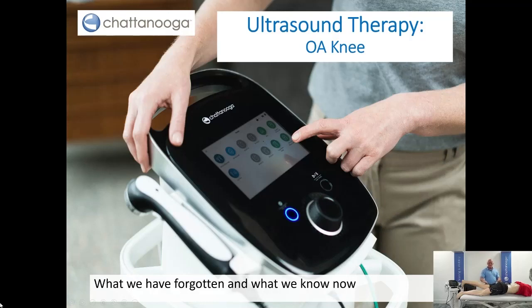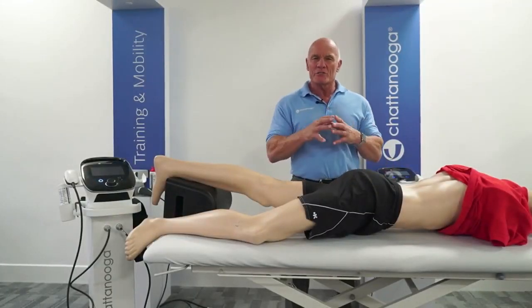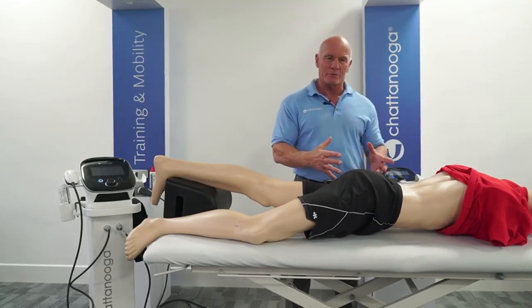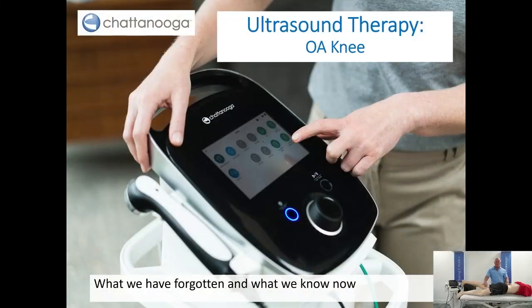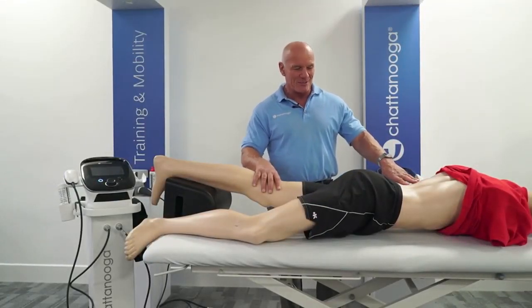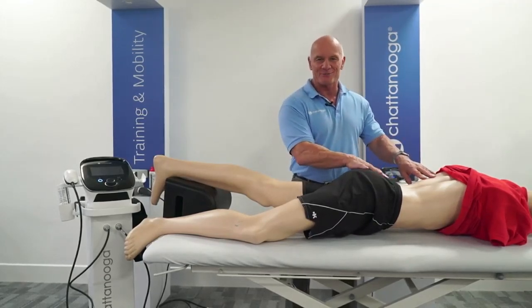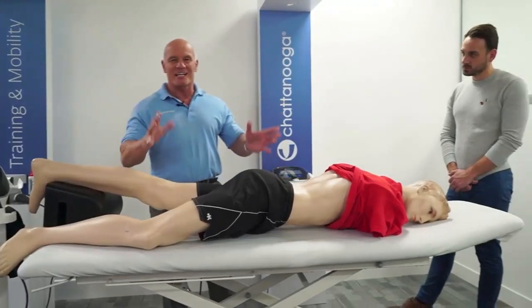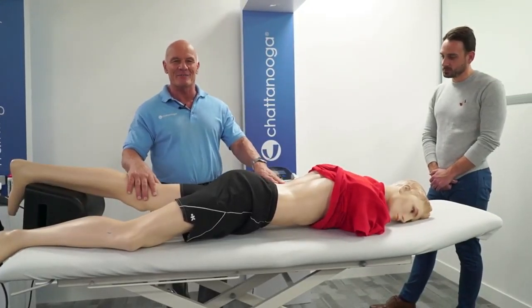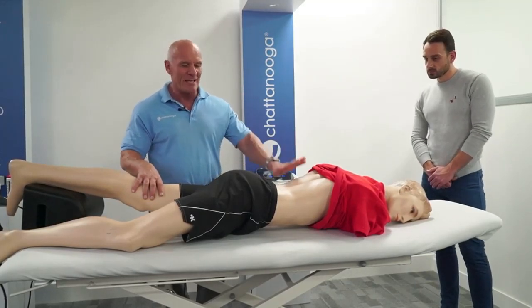So, before we move on to ultrasound, we wanted to show you a clinical example of how we can use radial pressure wave to treat low back pain. Now, we were due to have a patient with us today, so I now have the opportunity to introduce you to Fred. Due to the challenging times that we're currently living in, we couldn't have a patient and maintain social distancing, so Fred has very kindly volunteered.